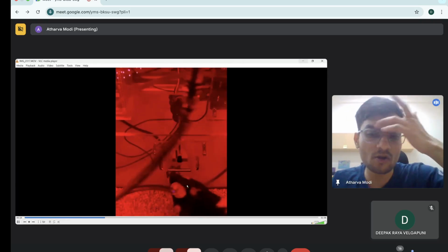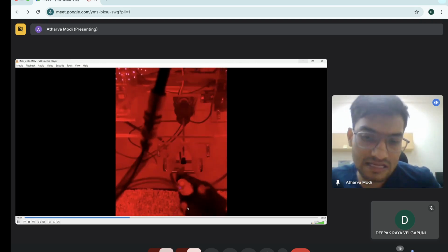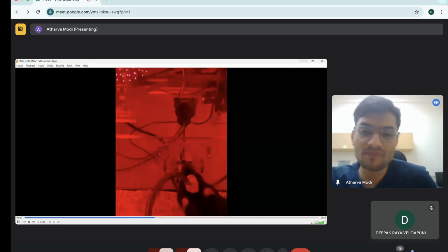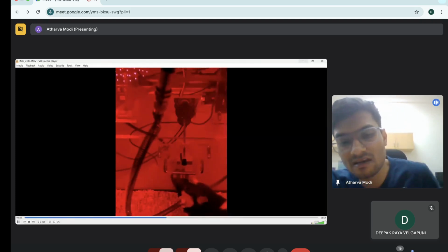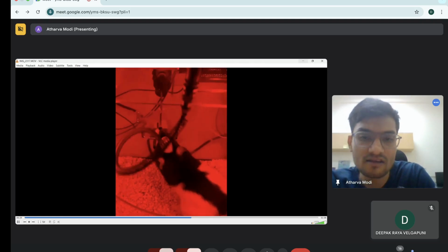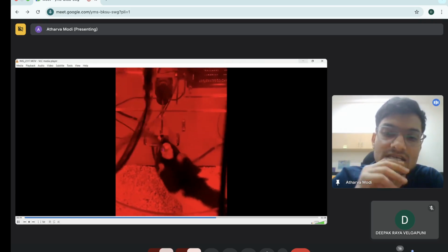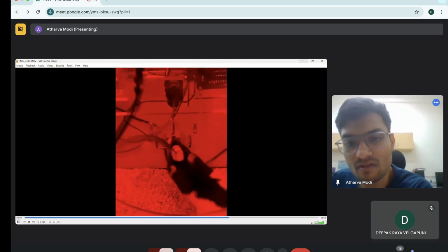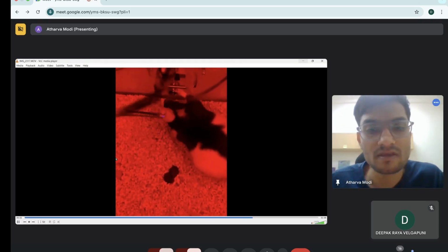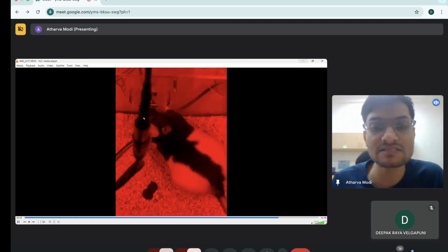So basically, this is an optical fiber on top of the head, inside the brain of the animal, and it's doing some task, and we are continuously measuring the activity. You can see that bluish or UV tint on the optical fiber at the brain. This is a pretty lightweight thing on top of the head, and it doesn't affect the rat's performance much. We are doing it under red light so that it doesn't affect the output.